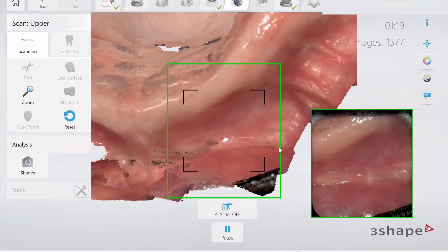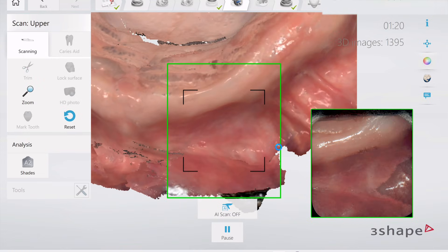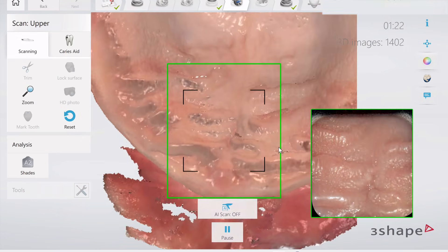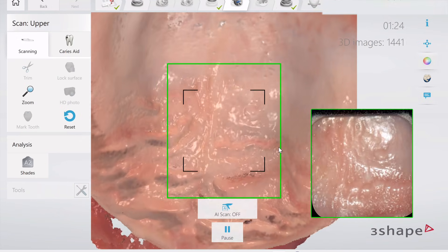And we're going to go all the way up into the anterior zone, which is kind of a tricky spot, and we're going to get that extended as well. And that, in a nutshell, is going to be our maxillary scan.